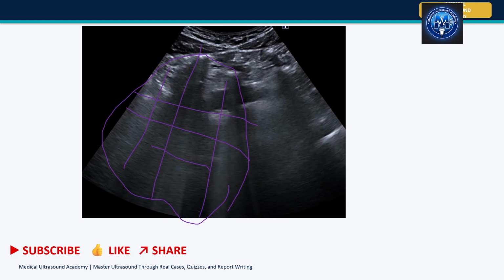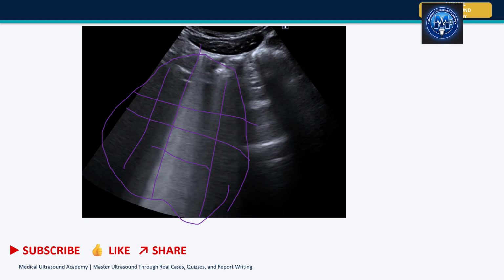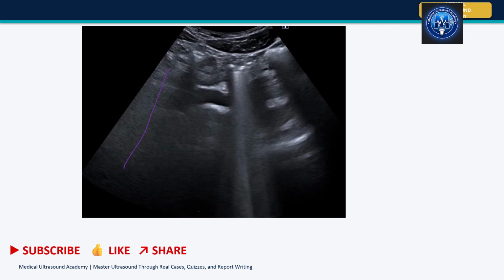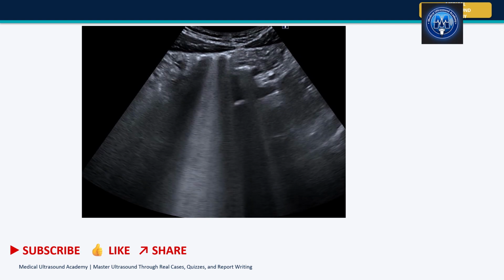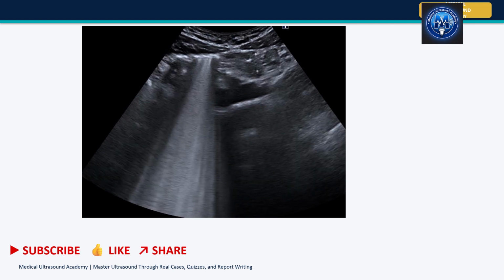Imagine someone's got acute appendicitis there. You can't tell the appendix is inflamed when there is gas, because it's all obscured. So a report that you write when someone is having bowel gas can be falsified, because some of the information will be missing, because you can't see the distal part of the gas itself. So distally here, you can't see what is going on there.